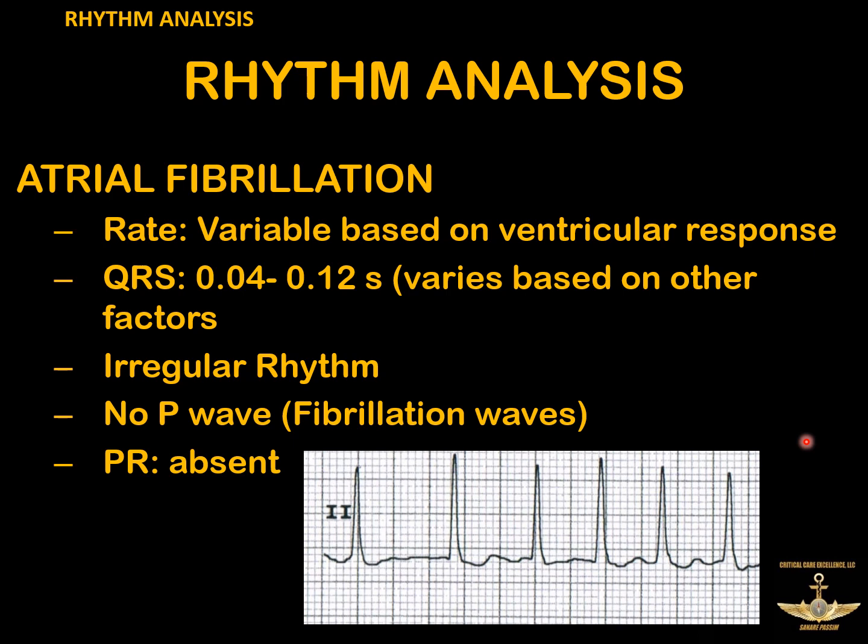So while you may have a ventricular rate anywhere between 60 and sometimes up to 300, your atrial rate is going to be anywhere between 300 and 1200 depolarizations a minute. And this is entirely based on where it's coming from in the atria, how many irritable places there are, and what this looks like.